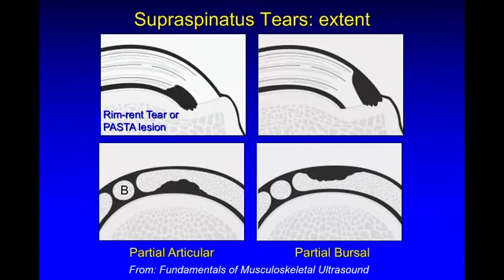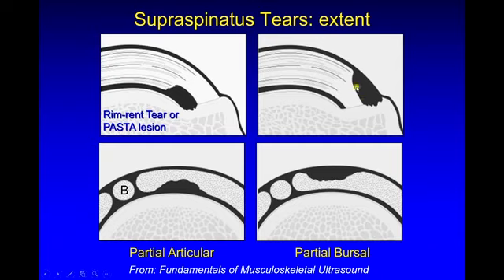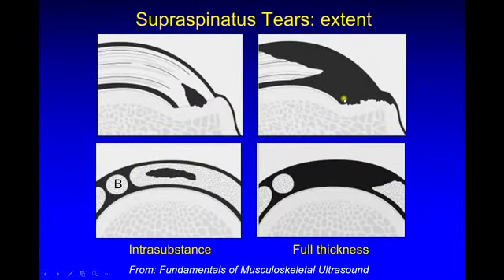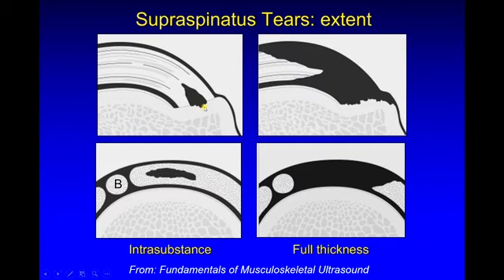When you identify an abnormality, we need to understand which surface of the tendon it connects to. If it only touches the articular surface and does not extend to the bursal surface, this is a partial articular-sided tear, also called a rim-rent tear or a PASTA lesion. If the abnormality involves the bursal surface but doesn't connect to the articular surface, this is a partial thickness bursal-sided tear. In both examples, the abnormality does touch the greater tuberosity surface, but because it does not connect the articular to bursal surface, we have excluded a full thickness tear. An abnormality buried inside the tendon is called an intrasubstance or interstitial tear, which would not be seen at arthroscopy or bursoscopy.